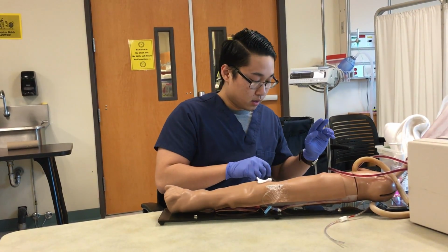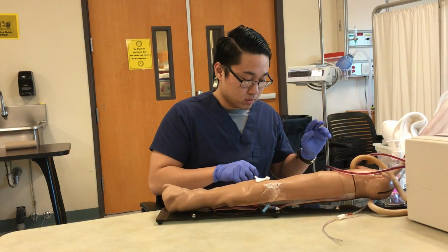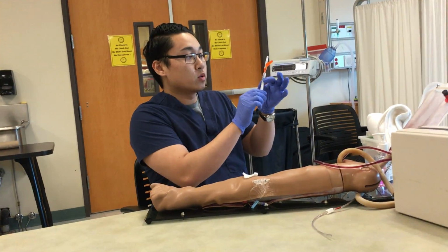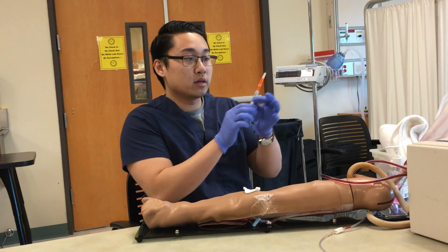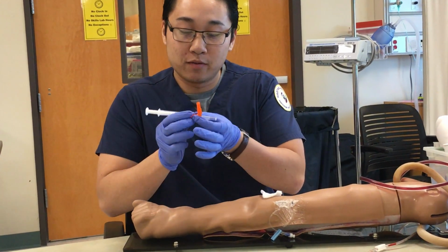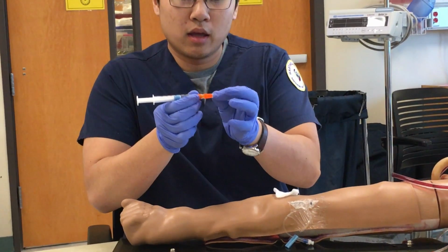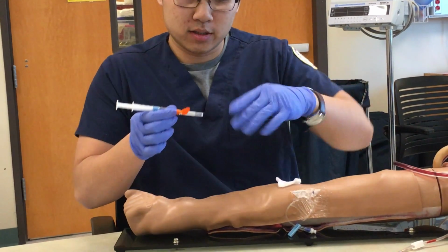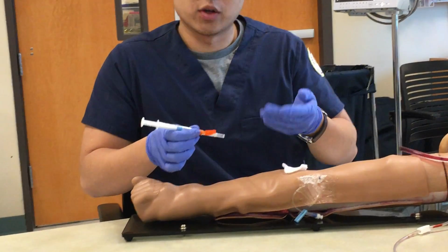Alright, now I'm going to set up the needle. For this stick, I'm only going to want 1 cc, and I have to make sure the bevel is facing up and the cap is facing away from me so I will not obscure my line of sight.